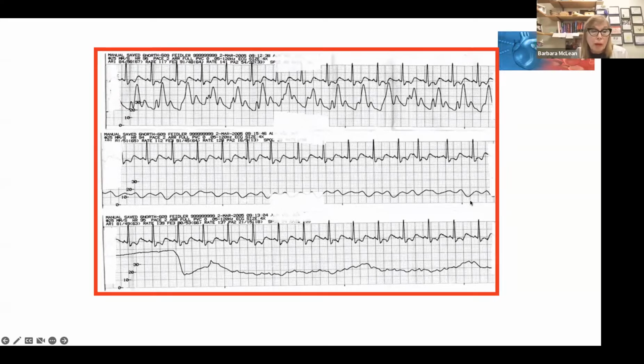Okay, so by the way, on insertion of the PA catheter, if you're the bedside nurse who's working with the physician on insertion, you're monitoring all those pressures as the catheter goes in. You need to record them because the physician is not going to have time to write that down, but you need to know that the PAD is 5 or less higher than the wedge pressure, 5 or less higher. I no longer need to inflate my balloon, and I'm just going to use PAD.